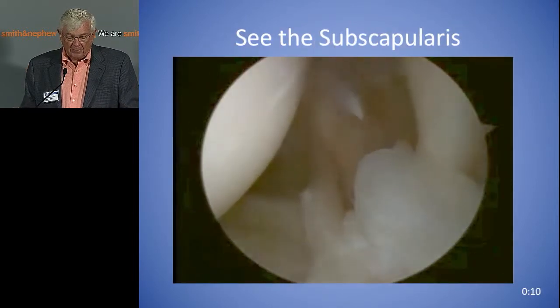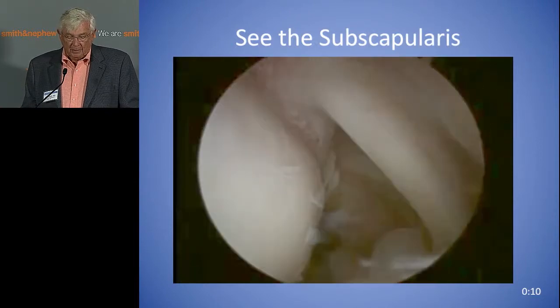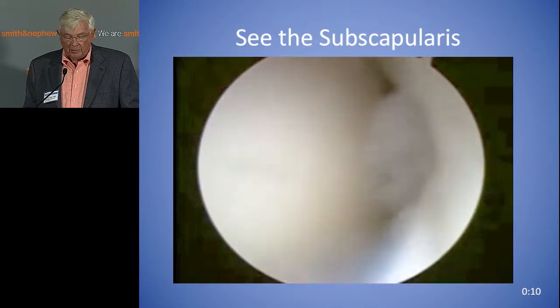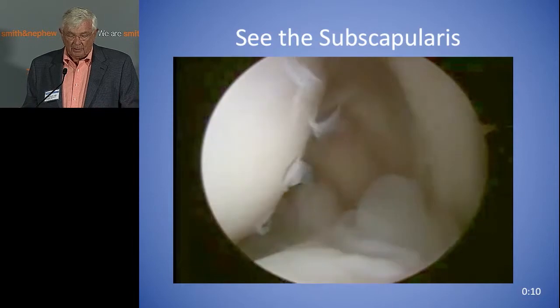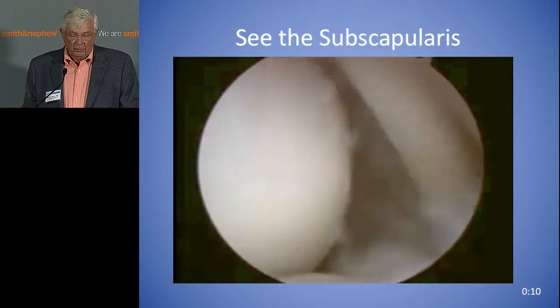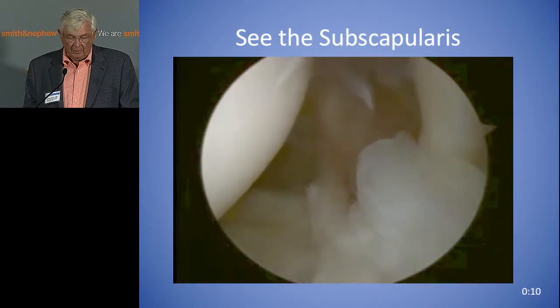Here's the subscapularis looking the same way — the subscap is on your right. You just internally rotate and you can get a look at the subscapularis insertion. Dr. Field is going to talk later about the subscap. So you can either pretend the subscap doesn't exist and there are no tears there, or you can actually take a look at it and see for yourself.